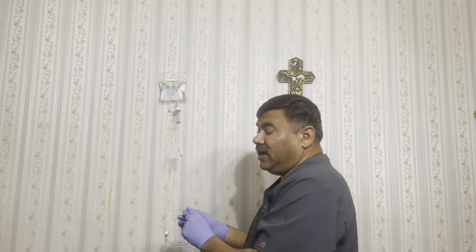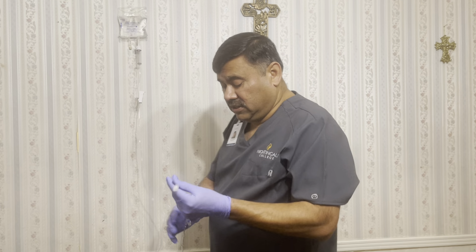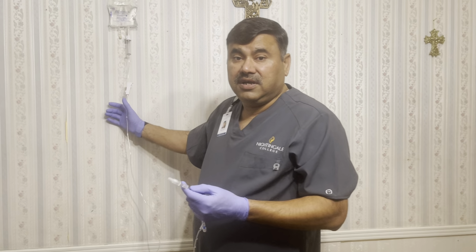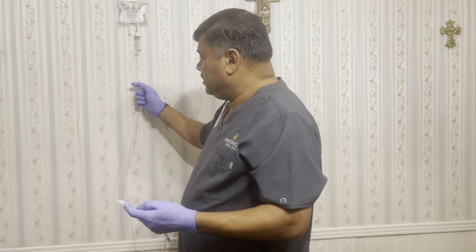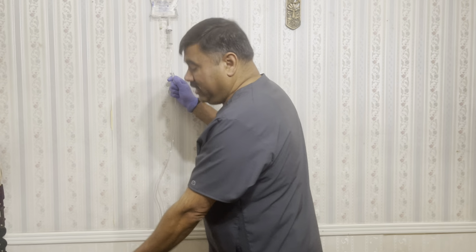Now that I have put that on, I'll be priming my whole IV so there should be no air. That is the safety step I'm doing to protect my patient. I don't want to give him any kind of air, so I'll be priming my tube. The reason for priming is to clear it. So I'll be opening up the roller clamp slowly.